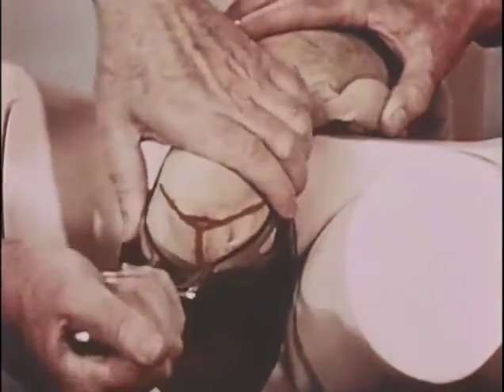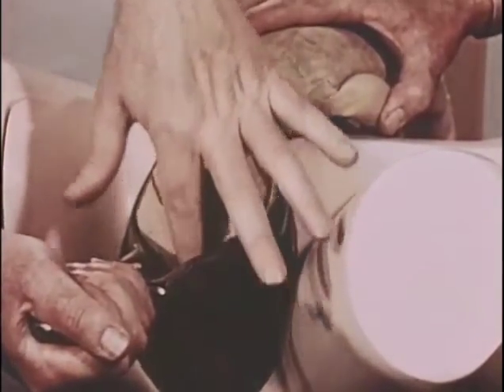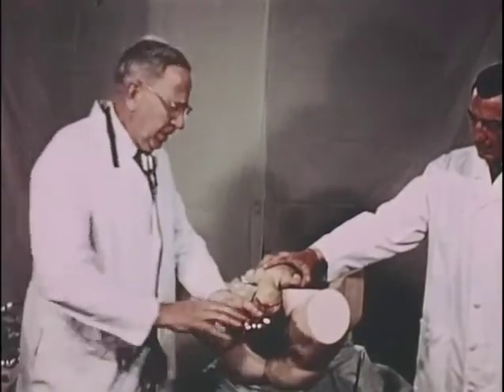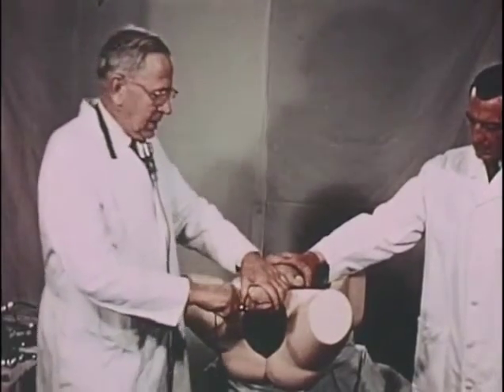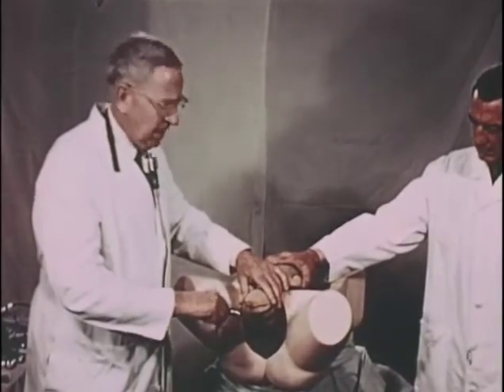So that eventually the sagittal suture is perpendicular to the plane of the shanks. One may have to repeat this maneuver two or three times, and even then, on occasions, is unsuccessful in complete success.